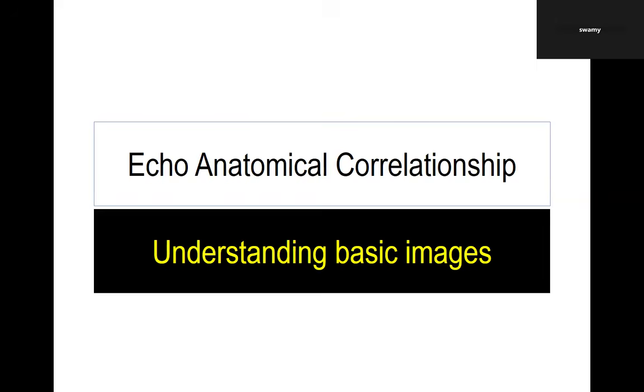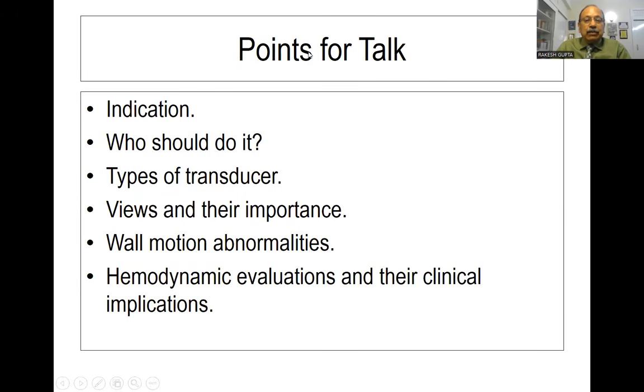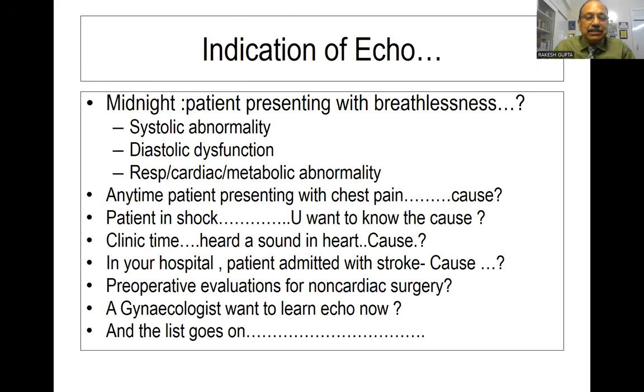When we talk of echo, we talk of understanding the basic images. And what are the benefits of echo? Absolutely non-invasive, no side effects, no trauma, cost effective, can be done n number of times. It provides a unique window to the heart and it gives you structural, functional, and hemodynamic evaluation of your heart. Points of talk would be indications, who should do it, type of transducer, view and importance, wall motion abnormalities, and hemodynamic evaluations.